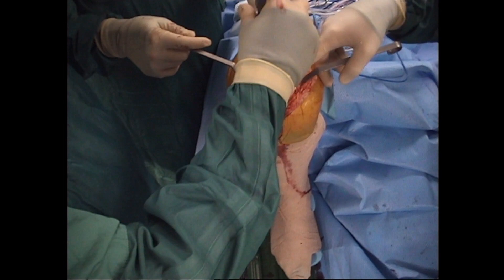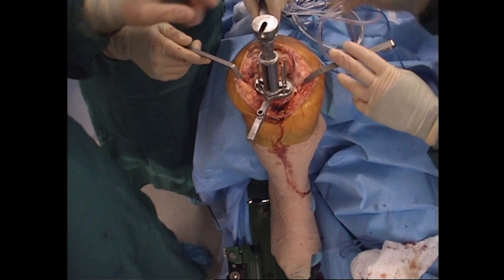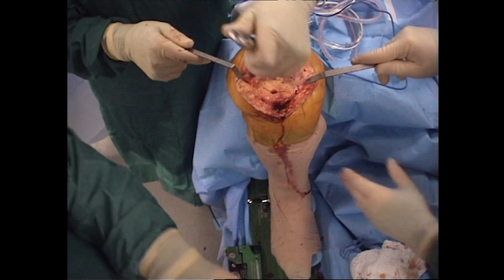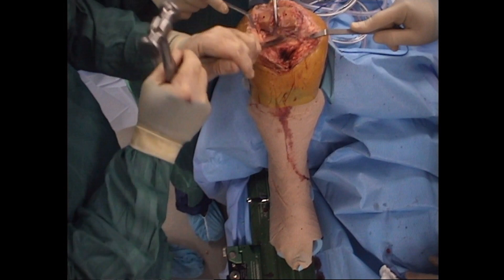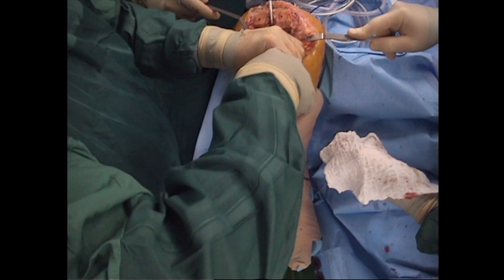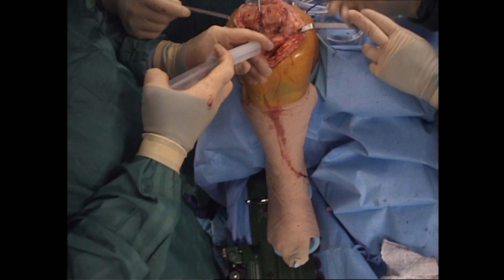The other pinholes are drilled, and the broach for the tibial keel is punched. This system does allow for metaphyseal stem extensions of 50, 100, and 150 millimeters. The bone hook is used to elevate the femur, and any residual posterior condylar osteophytes are resected with a curved osteotome. At this point, a posterior capsular periarticular injection is performed.